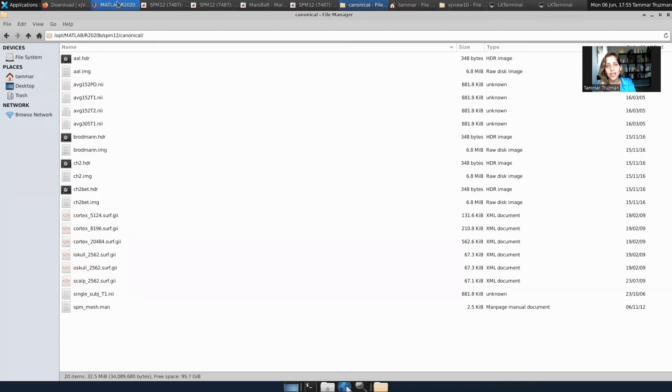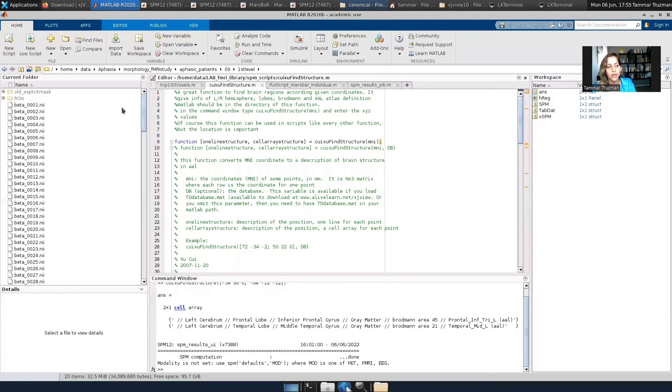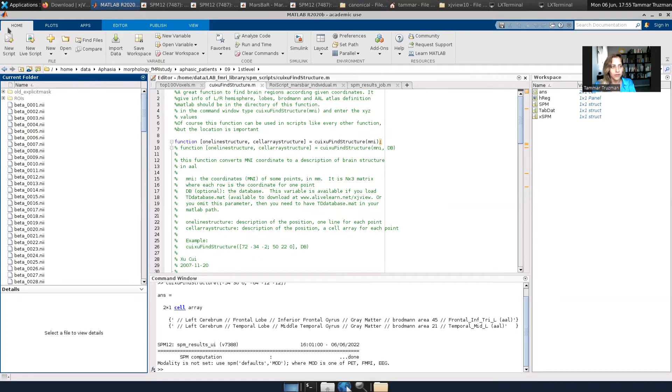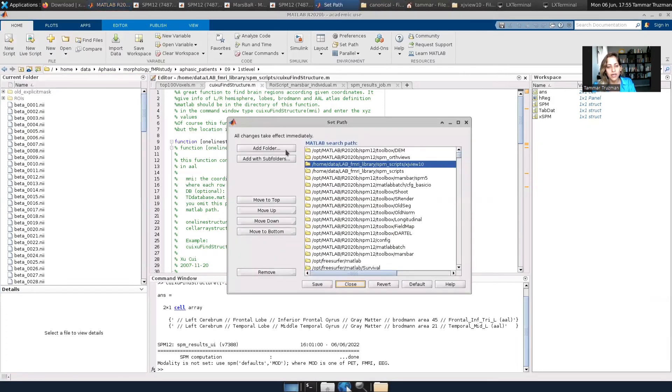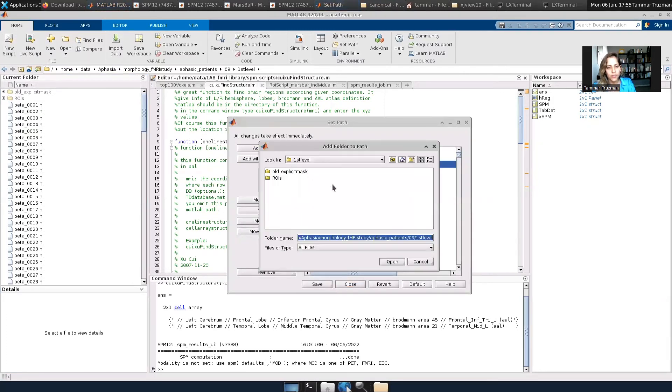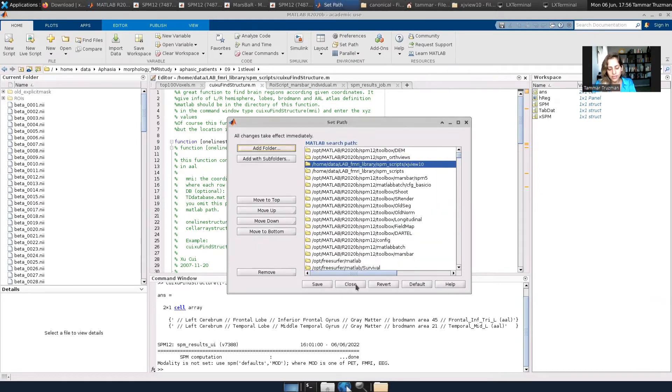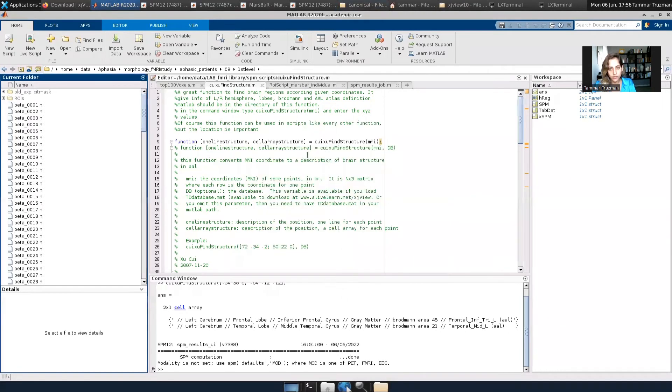The second thing I have to do is add the function and the other files that I downloaded to the MATLAB path. So I go to home, set path, add folder, then I find the folder where I just saved the files that I downloaded, open, then save and close.